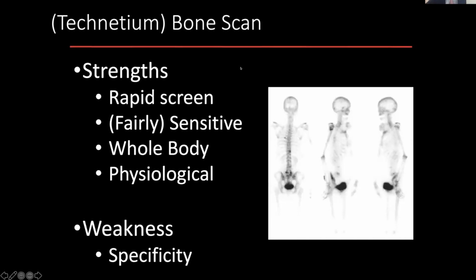Really quickly, nuclear medicine. Nuclear medicine is kind of the opposite of other radiologic evaluations. So, with the X-ray or CT scan, you take radiation from the outside, it goes through the patient and you measure what's left. With nuclear medicine, the patient gets injected with a tracer, which contains the radiation and which is linked to a particular physiologic process. That then gets detected. So the radiation comes from inside the patient out and gets measured by detectors.